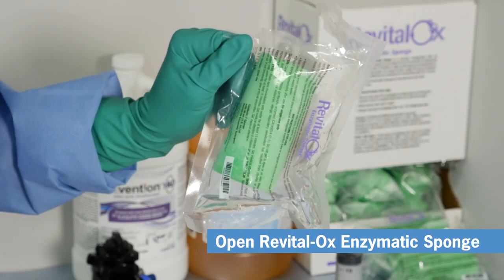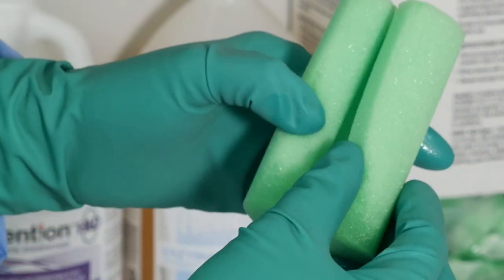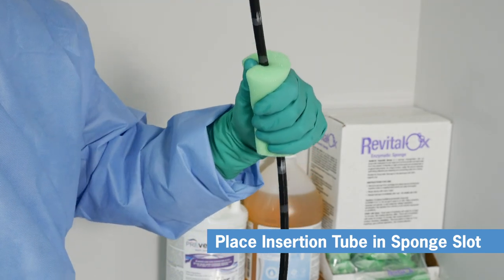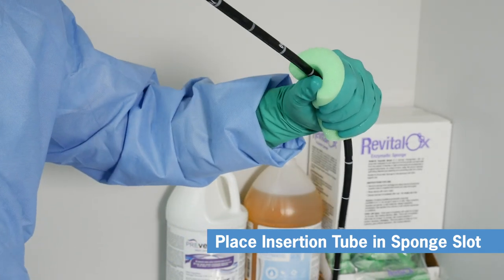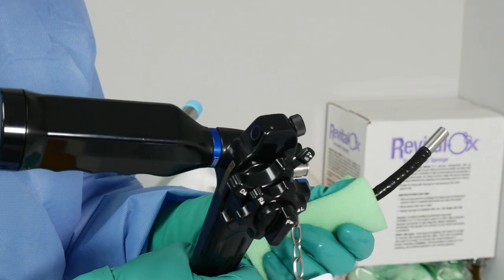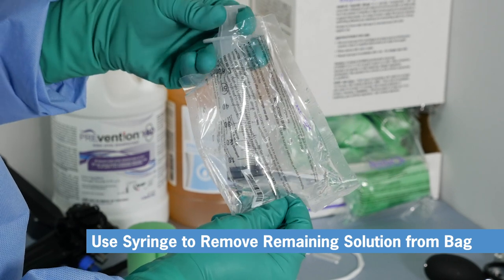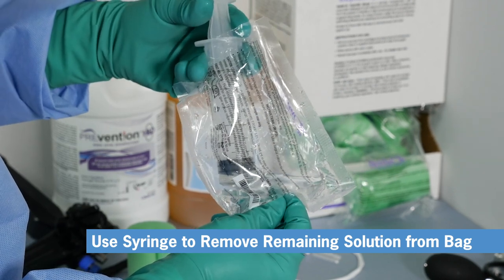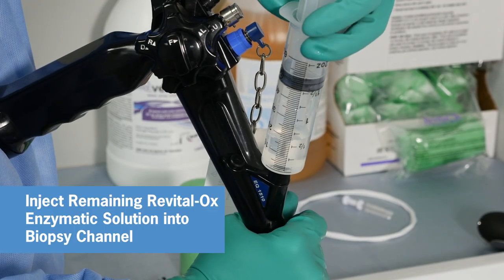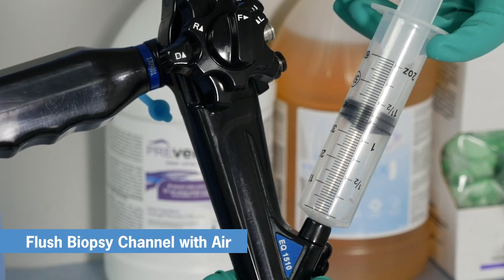Next, open one of the Revitalox enzymatic sponges. Note the slot in the sponge — place your insertion tube in the slot and run the sponge up and down the entire length of the insertion tube several times to remove any remaining visible bioburden. Now use the syringe to remove the remaining enzymatic solution from the bag and inject the solution into the Endo-i's biopsy channel. Flush again with air to clear the channel.